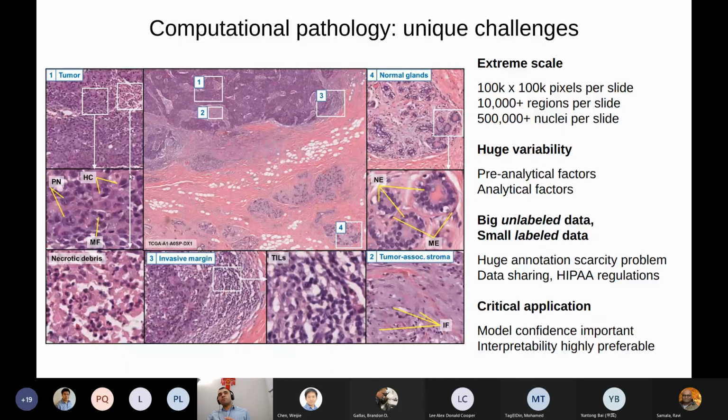And there's basically two competing paradigms currently, and I'm not arguing for one over the other. Both of them are important. But the one that I'm involved in is the detection of these individual regions and nuclei, and then using them for various things, for survival prediction, or for prediction of the immunotherapy response, and so on.